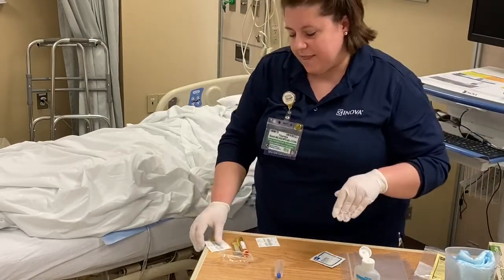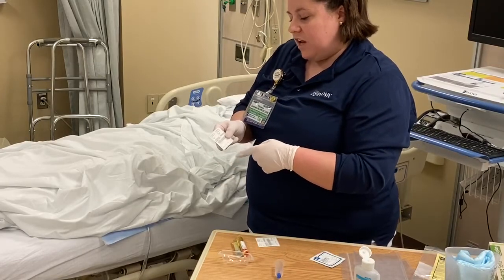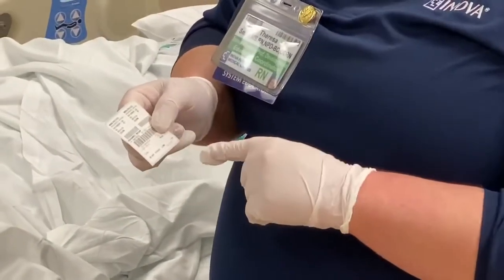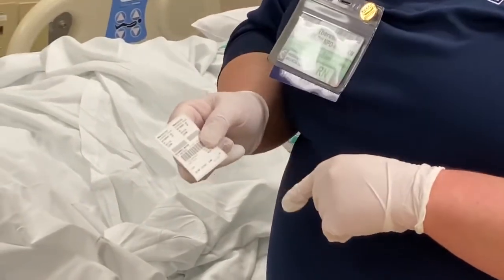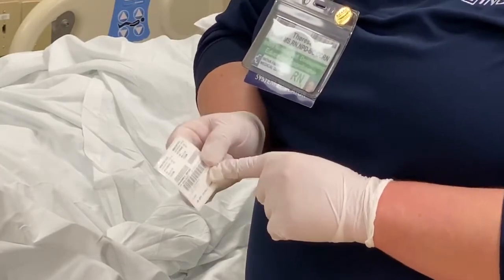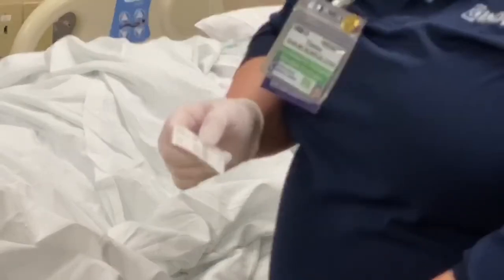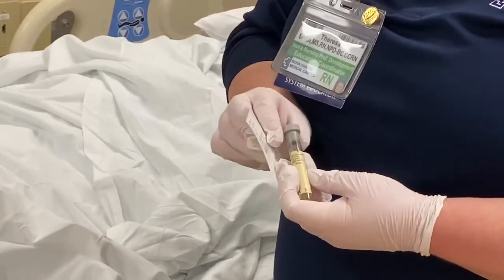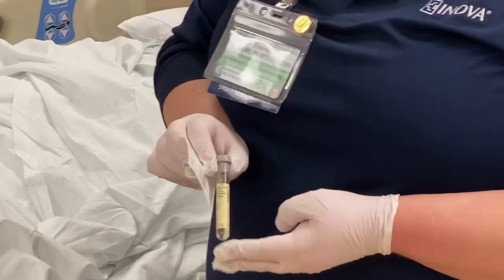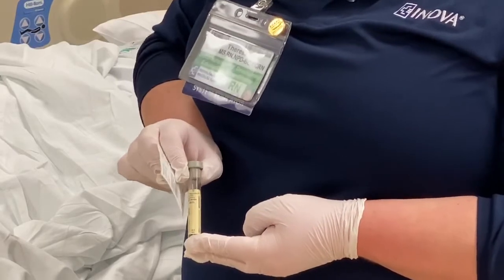When I get ready to label my tubes, I'm going to look at the labels that I have here. And if you look, you have 2 small labels at the top and 1 big label at the bottom. The big label is what I use to verify my give me 5, and this is the label that's going on the tube. So in my hand, I have the gray label, so I'm going to label my gray tube. Now, for my urine specimen, both of my tubes, both the gray and the red and yellow tube, have certain specifications for how I label them.